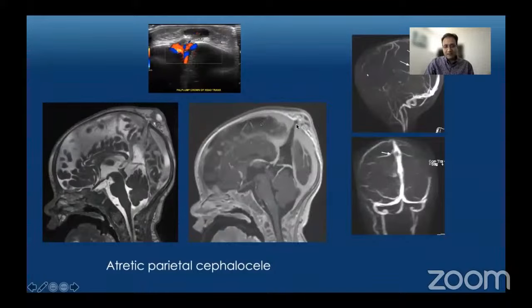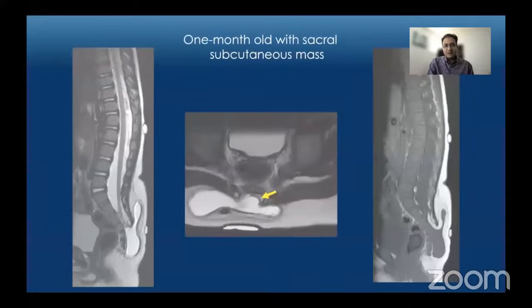On MR venogram images we see focal splitting of the superior sagittal sinus, related to where the tract bisects it to reach the calvarial defect. The next case is a spine case: a one-month-old child presenting with a sacral subcutaneous mass.